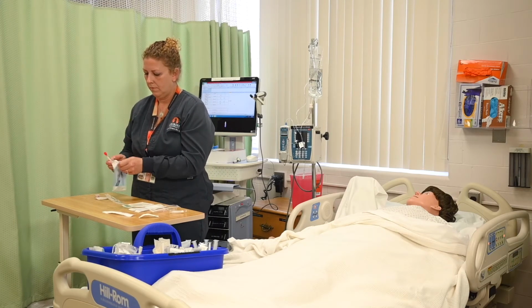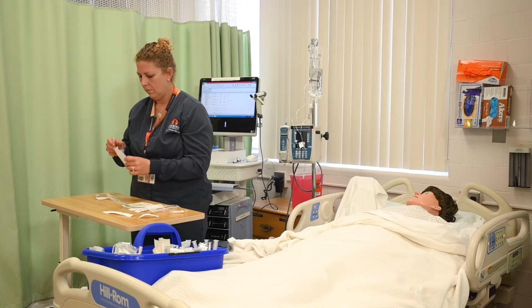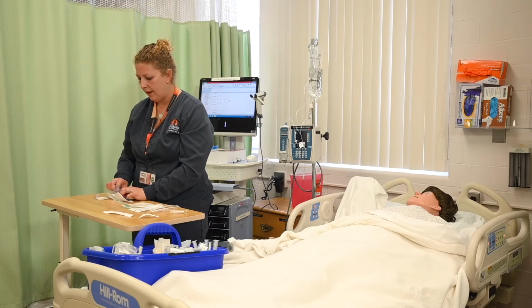Sarah will now prime the extension tubing or INT with normal saline flush, maintaining sterility. Leave the normal saline attached to the tubing. I'm also going to loosen the cap on the end so it's easy to take off when I need.